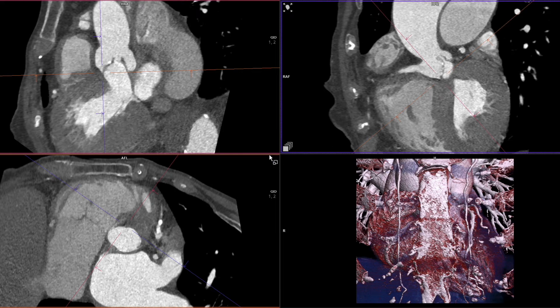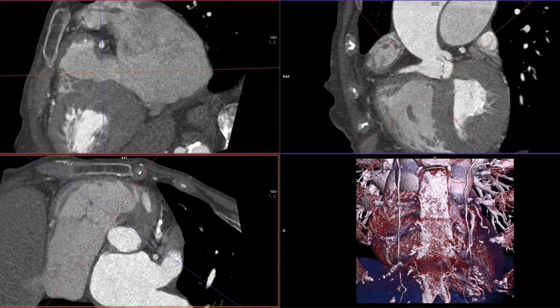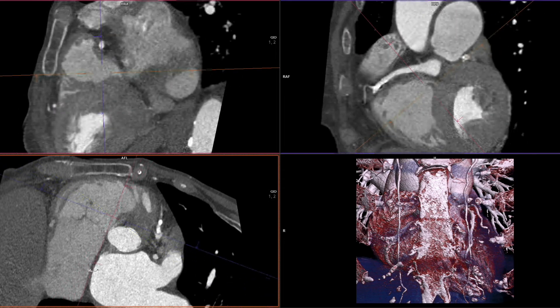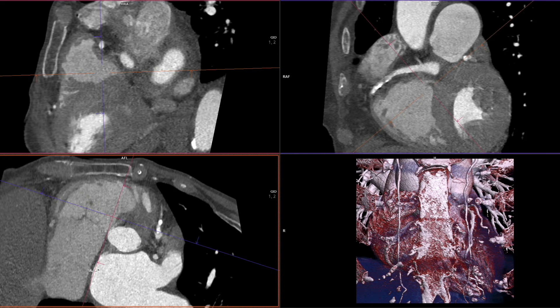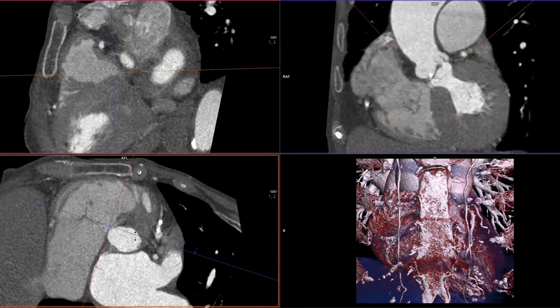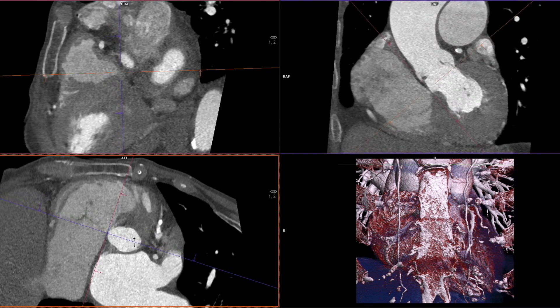Then we turn to the lower left-hand image and move the pink line towards the membranous septum and align it in the course of the septum. Then we pick the blue line and move it up and down until the lowest point of the beginning of the muscular septum is reached in the upper right-hand image.